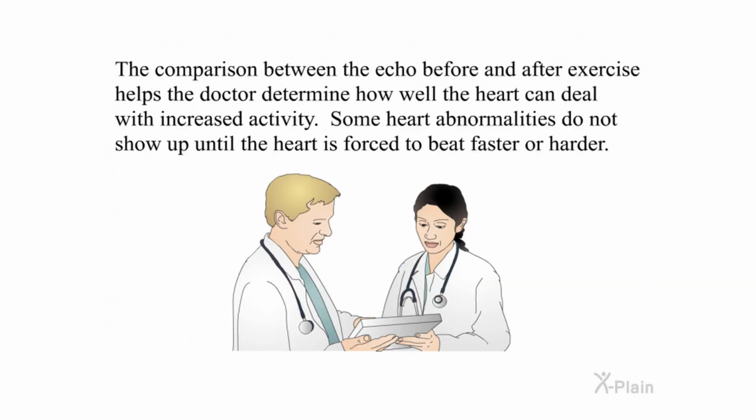The comparison between the echo before and after exercise helps the doctor determine how well the heart can deal with increased activity. Some abnormalities do not show up until the heart is forced to beat faster or harder.